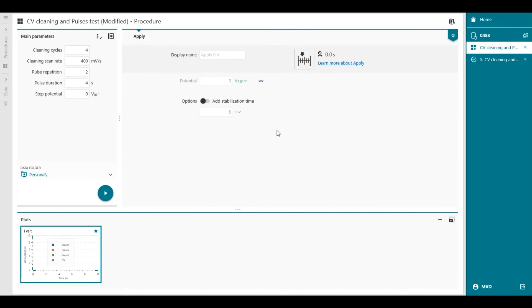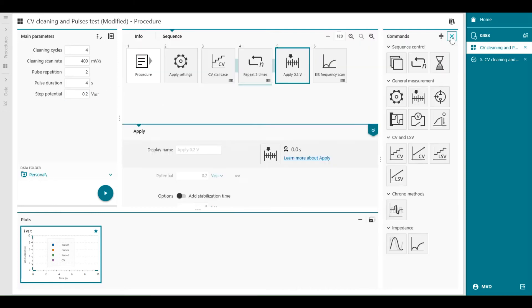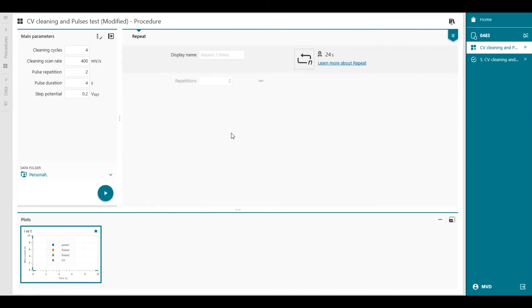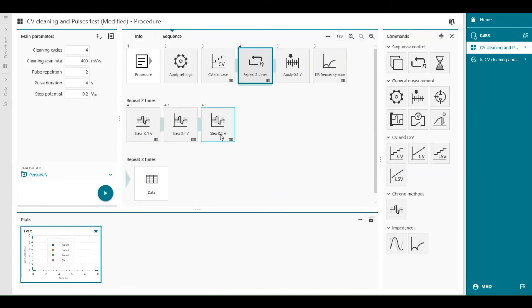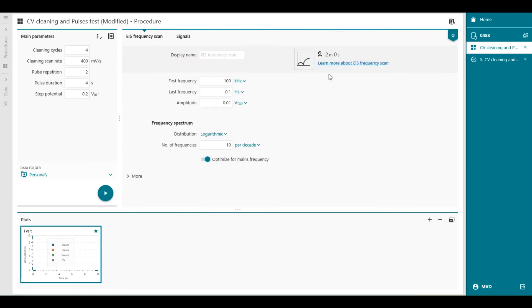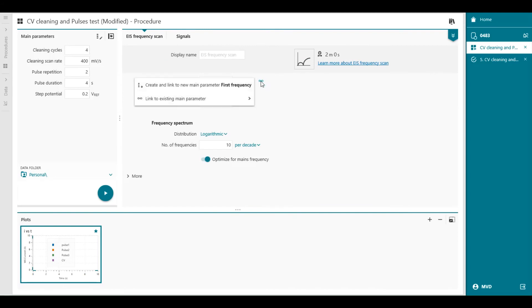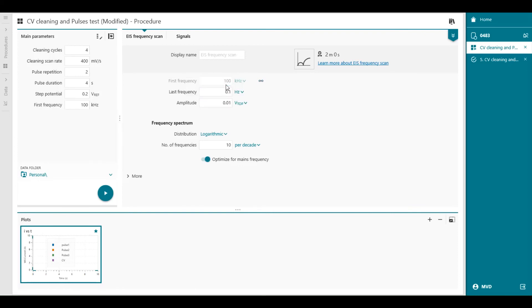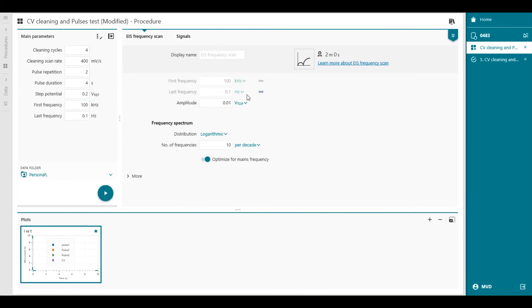So at the moment, it's zero volt, but I can modify this to 0.2 volts, for example. And you will see that the last pulse is also 0.2 volt now. The frequency scan, we can also link the parameters to the main parameters, like main parameters. First frequency, last frequency, and well, that's the most important, then amplitude, we leave it as it is.